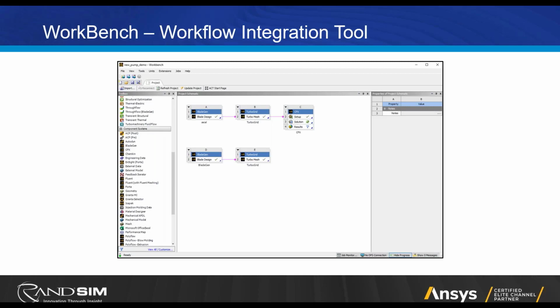So it may look different when you bring up the software, but you start generally with the geometry side. So we grab a geometry little icon and drag it into the main window here. Then from there, you go to meshing. I don't know if you can see this too well, but that's the TurboGrid section because we're looking at a pump, and I'm going to talk about that briefly. Then you go on to the third box there, CFX, where you run the flow solver and post-process the results.